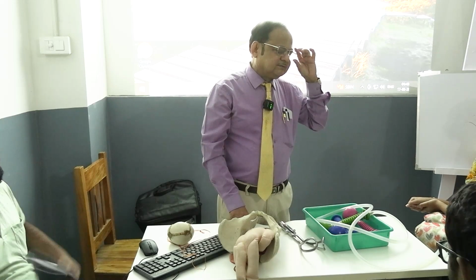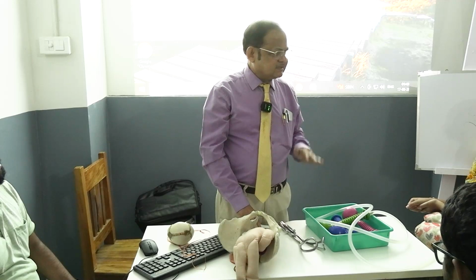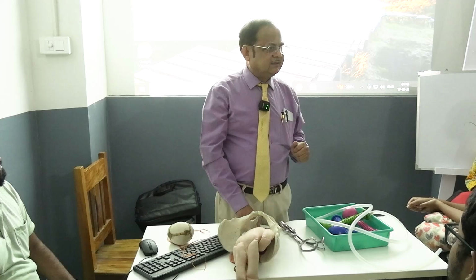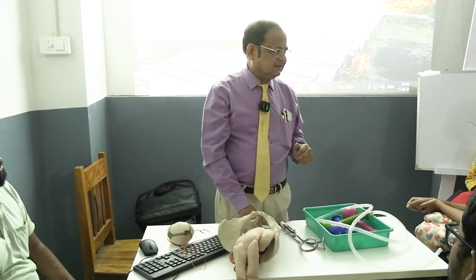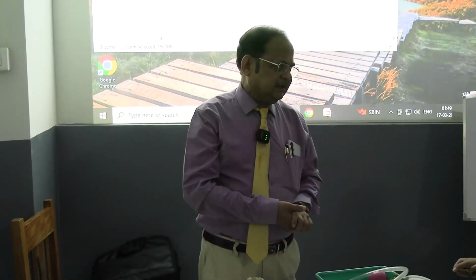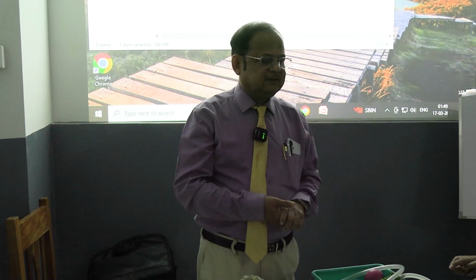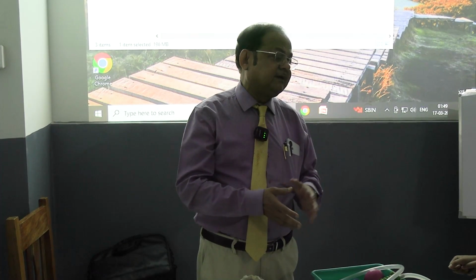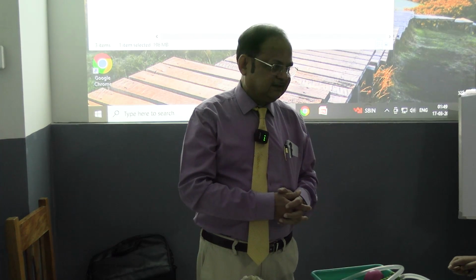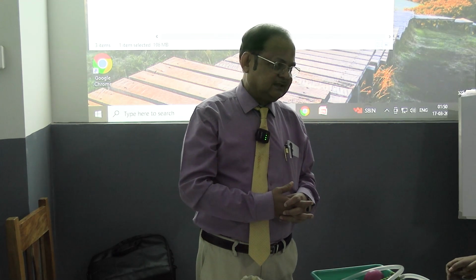Our aim is that it can be delivered vaginally. Sometimes there may be some problem of vaginal delivery, where some aid is needed, some instrument is needed to deliver the baby. And this is called instrumental vaginal delivery. An American prefers to say it is operative vaginal delivery. Better term is the instrumental vaginal delivery. The fetus is delivered by the instruments.